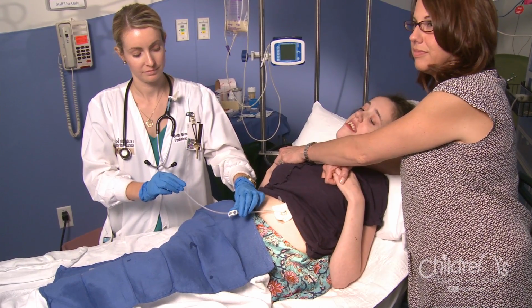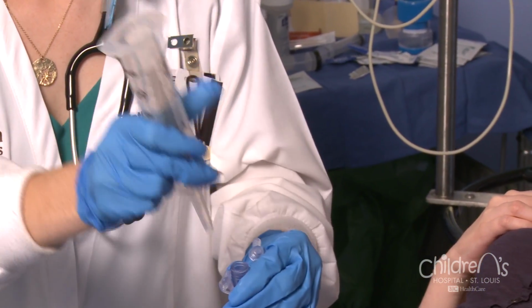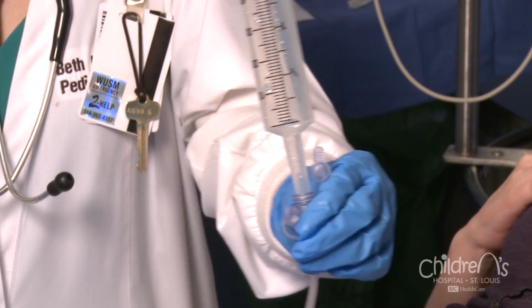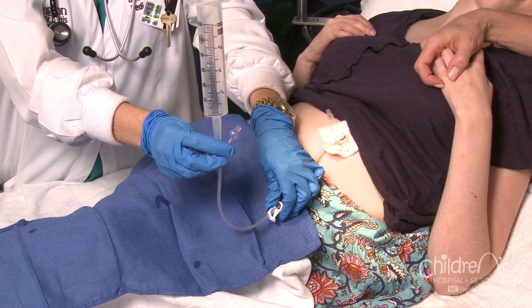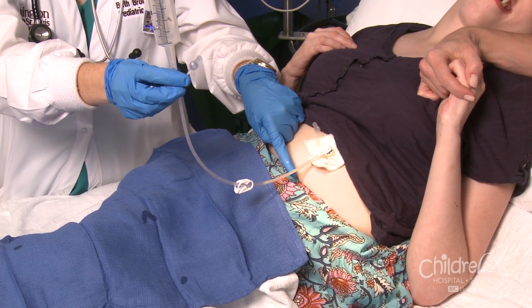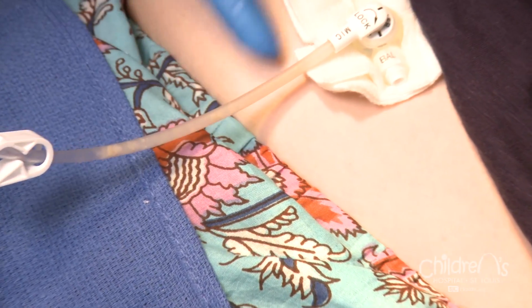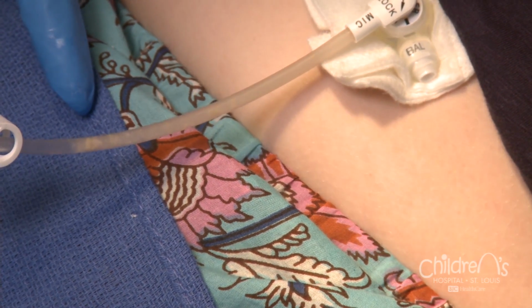Using a syringe, clamp the extension set and attach it to the button. Take the feeding syringe without the plunger and attach it to the extension set. Hold the syringe about the level of your child's stomach and unclamp the extension set. You will see excess gas bubble up into the syringe. It is not uncommon to see formula or stomach juice rise into the syringe. Once the gas is relieved, allow the formula or stomach juices to slowly flow back into your child.